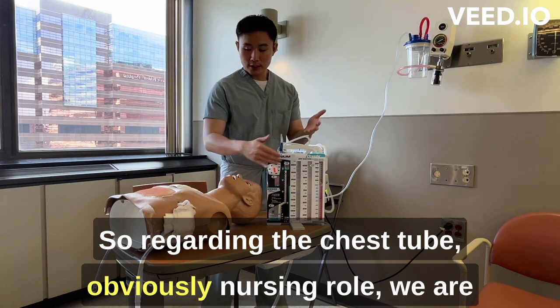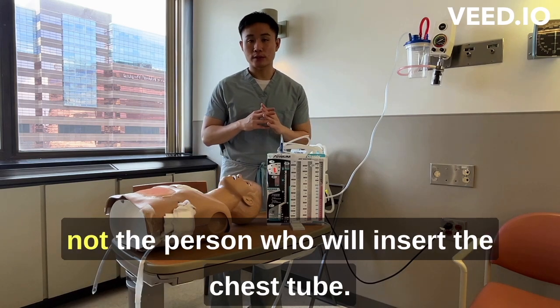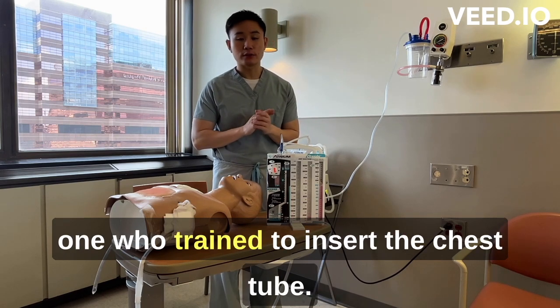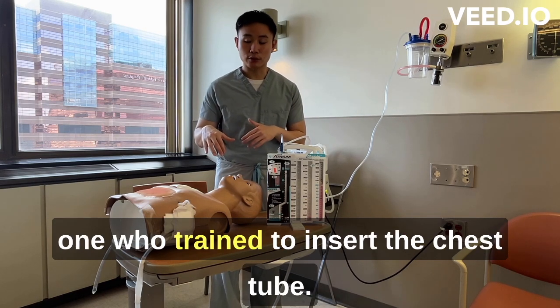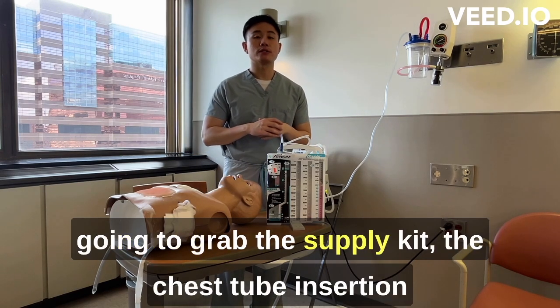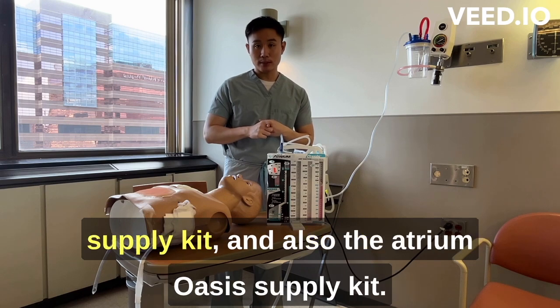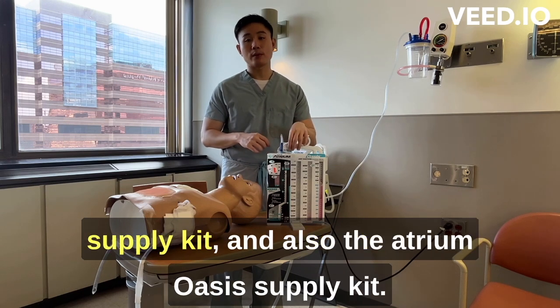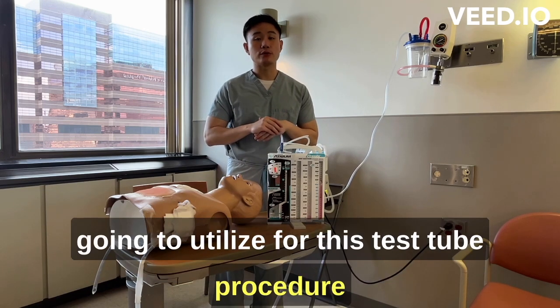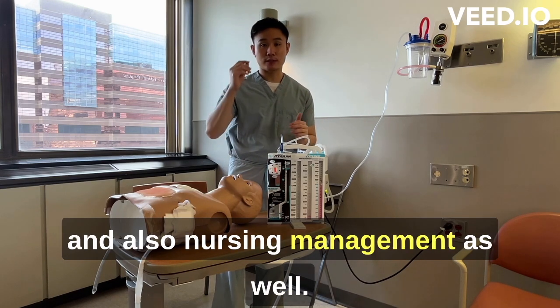Regarding the chest tube, the nursing role is important to understand. We are not the person who will insert the chest tube — the medical doctor, provider, or PA is trained to do that. As nurses, what we're going to do is grab the supply kit: the chest tube insertion supply kit and also the Atrium Oasis supply kit. These are the two kits we will utilize for this chest tube procedure and nursing management.